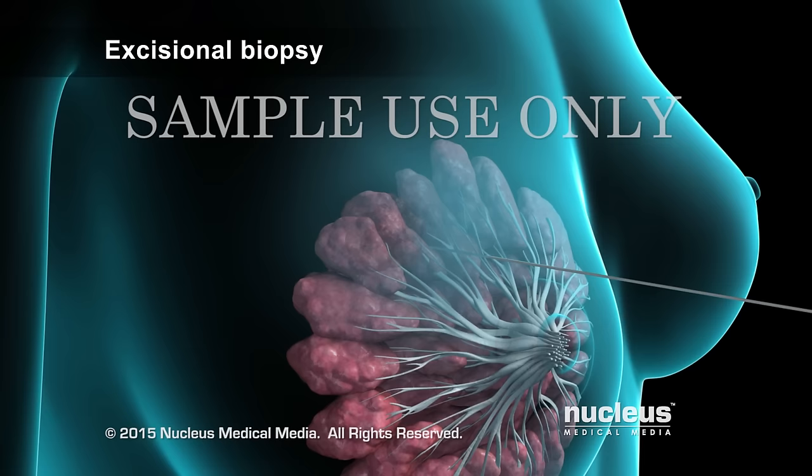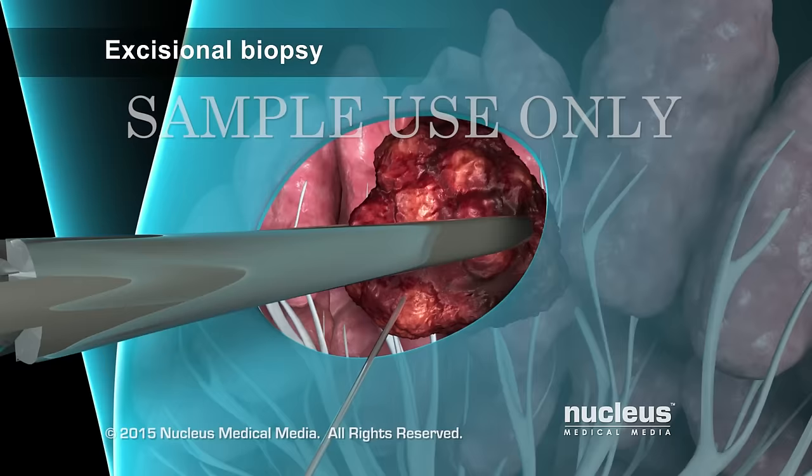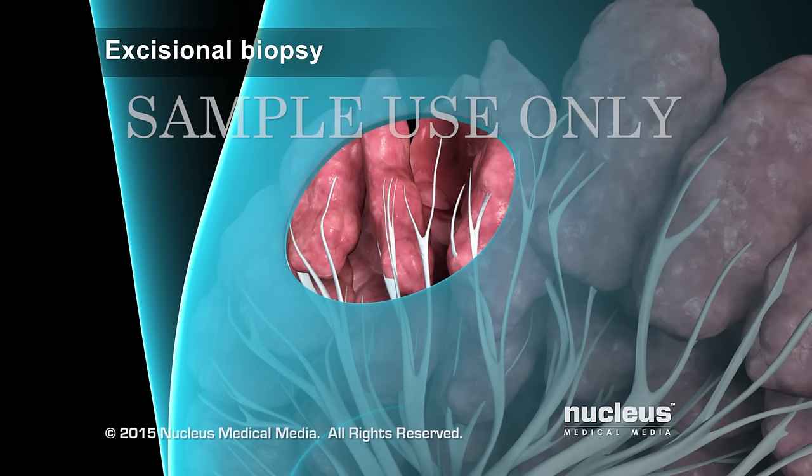You will then go to the operating room, where your surgeon will make an incision in the breast. He or she will follow the wire to locate the targeted area, then remove it. An X-ray will be taken of your breast to make sure the targeted area has been removed. Then, your surgeon will close the incision.